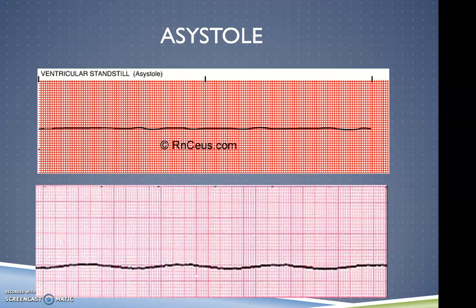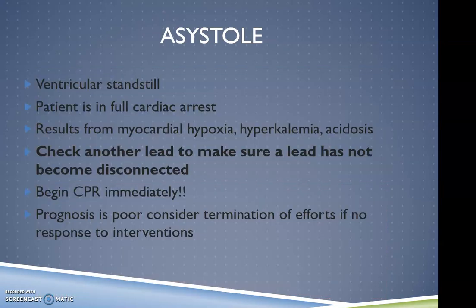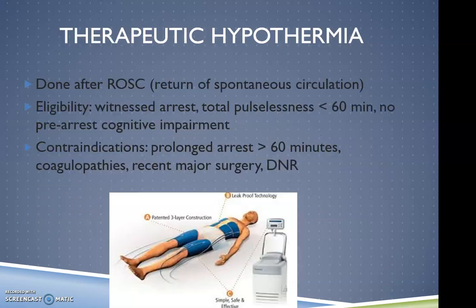And I know on TV, you'll see them shocking this. This is not a shockable rhythm. You do not shock asystole. There's no activity there to shock. It's total ventricular standstill. Patient needs CPR, needs our algorithm of medications, epinephrine, etc. to give. However, once you find someone in asystole, the prognosis is very poor. Usually there is no resuscitating someone that is in asystole.